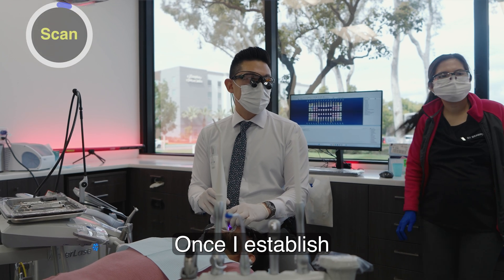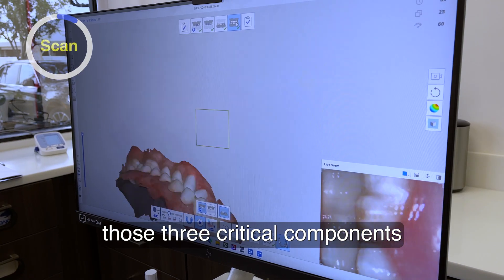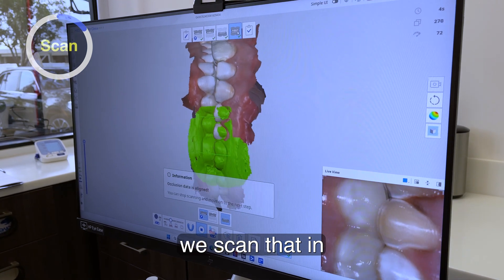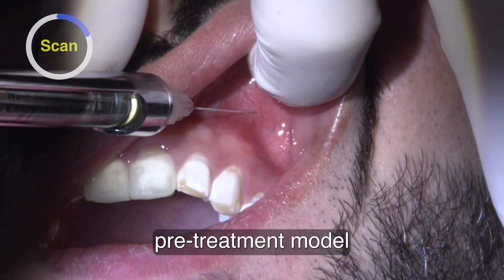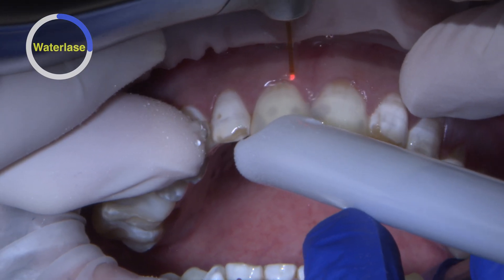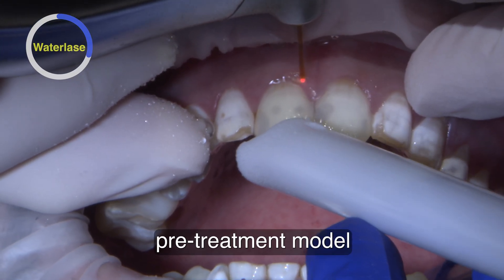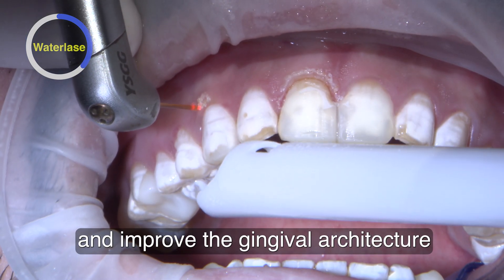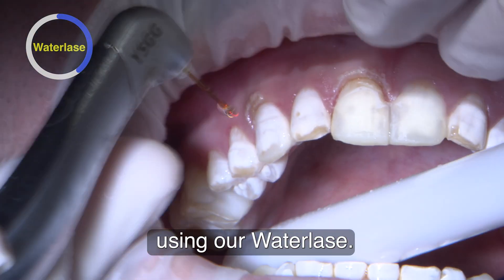Once I establish those three critical components at the centrals, we scan that in as our pre-treatment model — that's going to help guide all of the designs. Once we get our pre-treatment model of the upper and lower, I'm going to go through and improve the gingival architecture using our Waterlase.